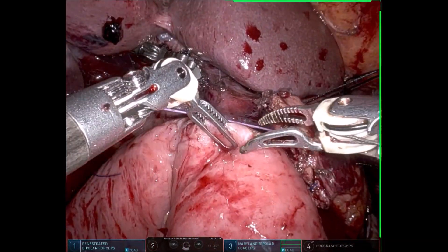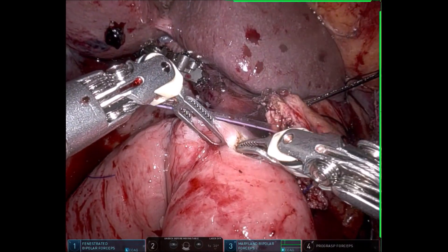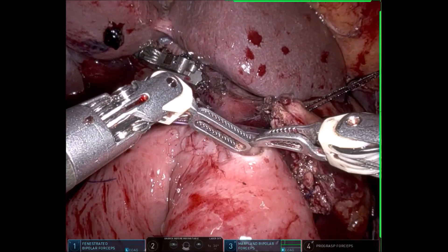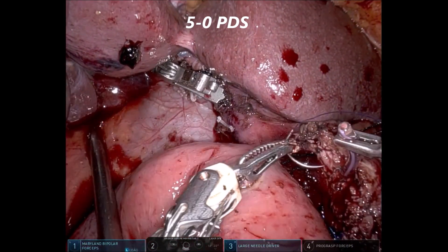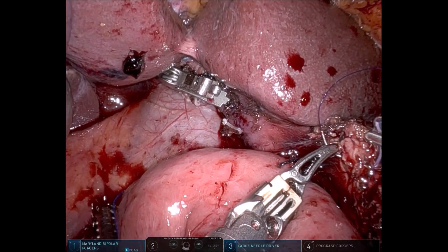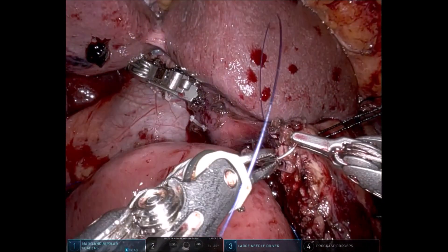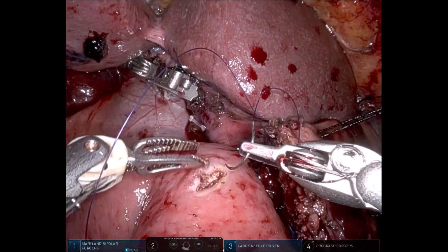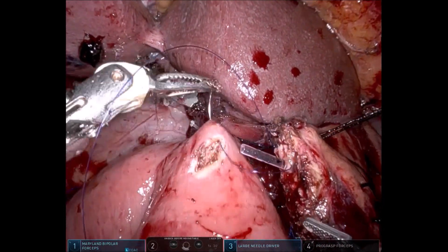Essentially three 20-centimeter 2-0 silk sutures are used. We then make an appropriate enterotomy — the serosal opening is slightly bigger but the mucosal opening is appropriate to that of the duct. This is a case of periampullary malignancy; the duct size was 3 to 3.5 millimeters. We have inserted a 6 French feeding tube.